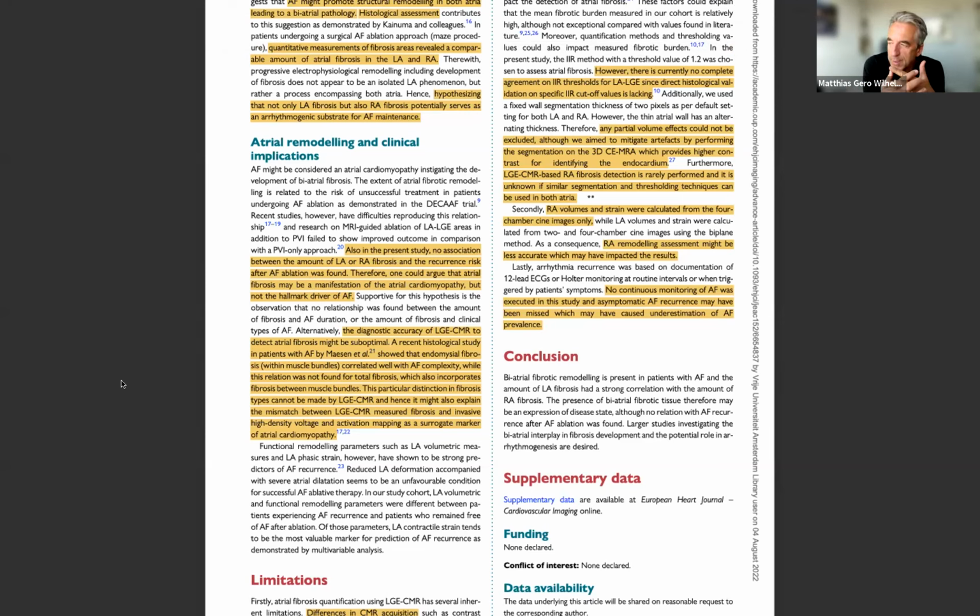But of course, one of the key questions always is how confident can we be in our methodology to assess the atrial wall, because it's thin, and we only have, as you said, basically a biplanar view of the atria, and the atria do not necessarily have a geometrical shape if your axis is slightly off. So how confident do you think, or did you feel, when you did the evaluation? A question to you and Luke maybe.